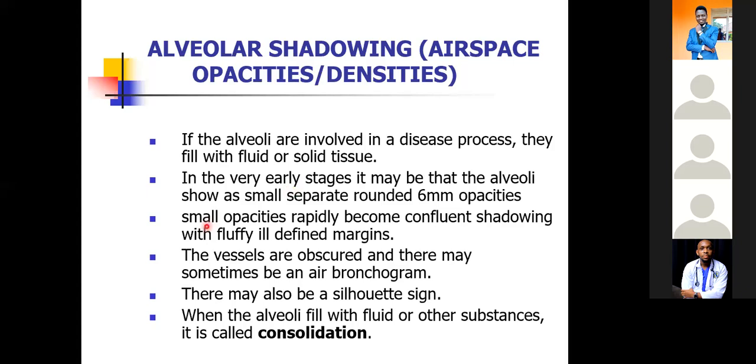As that process progresses, the vessels or the vascular markings that you saw in the normal lungs become obscured. And at this same stage, we may begin to see or appreciate air bronchograms.